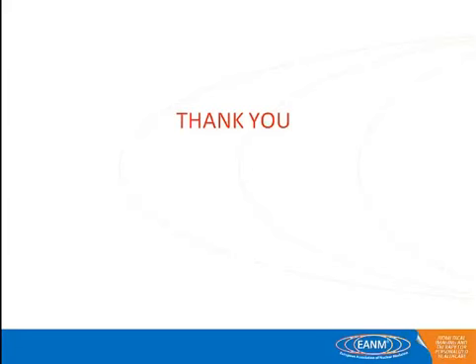The fact is that when you have to do it, you also have to do a diagnostic CT with intravenous contrast. So it really takes a lot of time. It can take 1 hour to do that, and so you have to think about it. But if you have a PET CT with diagnostic CT on site with a dedicated PET, then you're going to do the CT as well as the PET for the management of the patient. Yeah. You can really have a full schedule for the patient. In one session, you can really have a good, confirmed diagnosis and planning for the therapy. It's possible. With some effort, we can do it also in our department, but we actually do not do it.